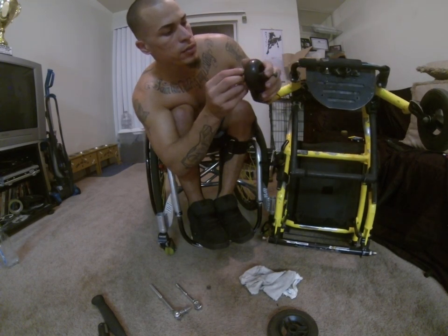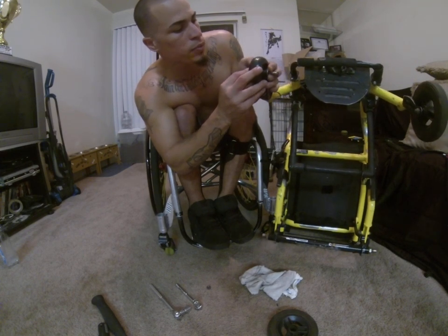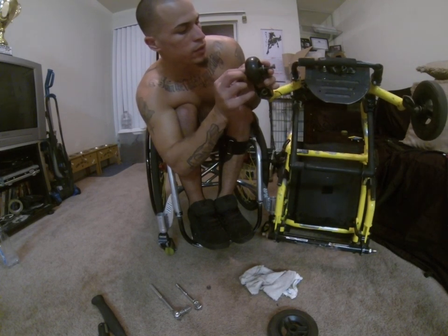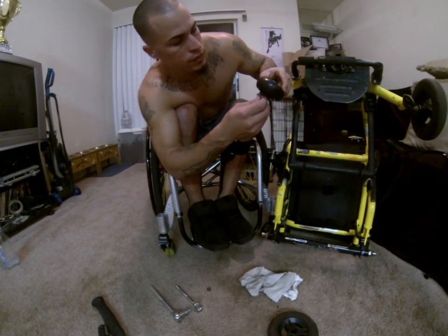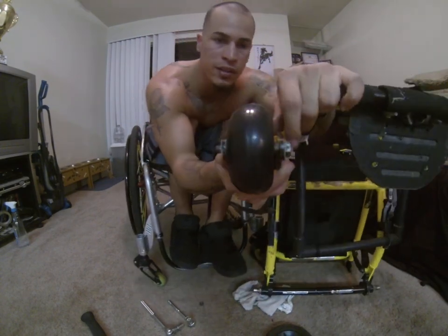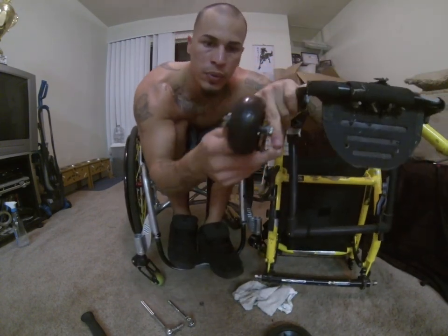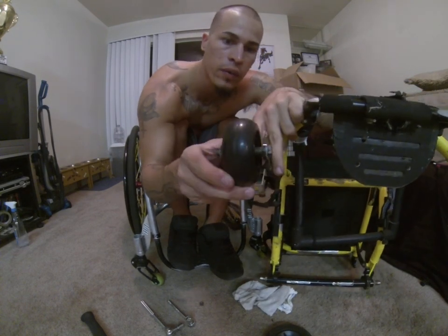This is a little hard sometimes if they don't want to fit. So you're gonna have to play with it for a little while and see if you can make it work. So there it is. That's pretty much it. It takes a few minutes to put these little spacers in here. Once you get those in there, you're good to go.